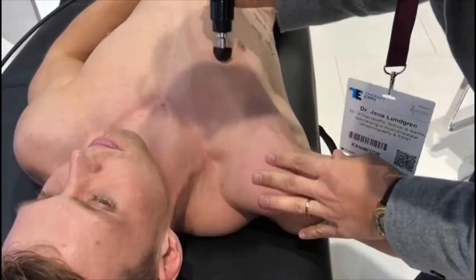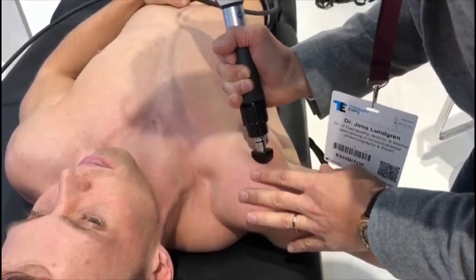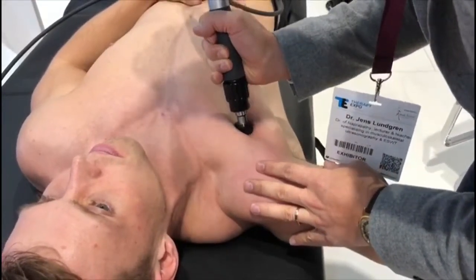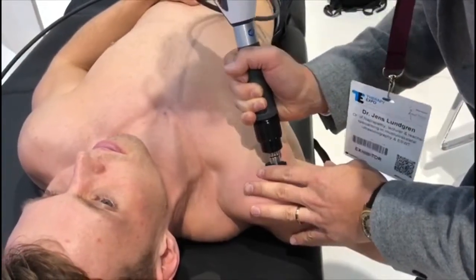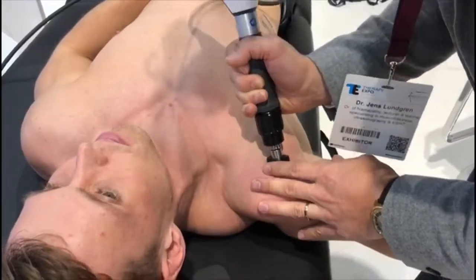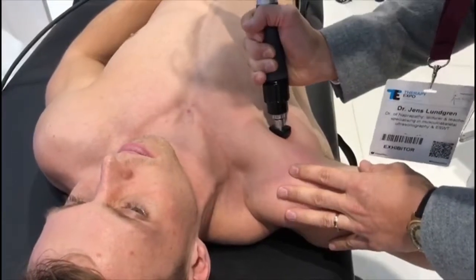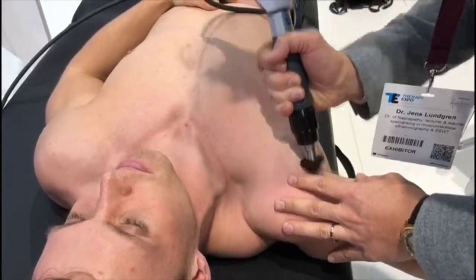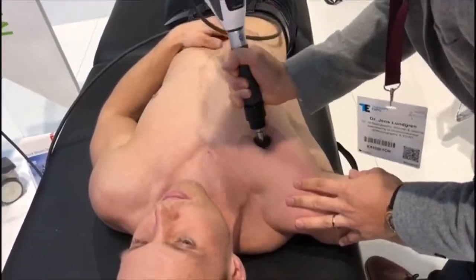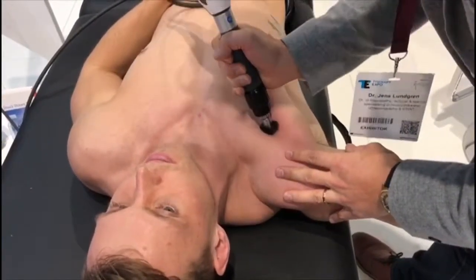This is quite similar to other types of treatments when it comes to fascia release, which is very popular today. The big difference is that I can put my settings in the machine to recreate the same treatment every time. I know that I have a certain pressure, I have a certain frequency, so it's a lot easier to control the treatment. Because if I use my fingers — if I'm in a good mood, maybe I'll be stronger and put more pressure, and if I'm in a bad mood or tired, I will do a completely different treatment. But when I use the shockwave, it's easier to standardize.